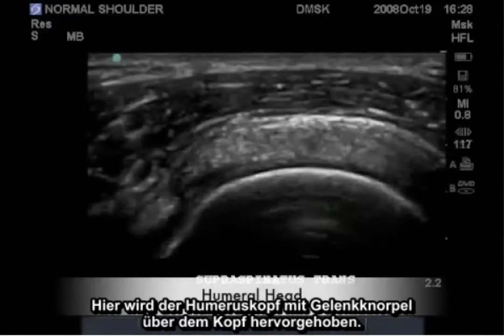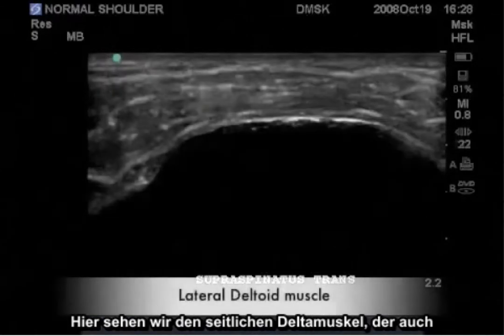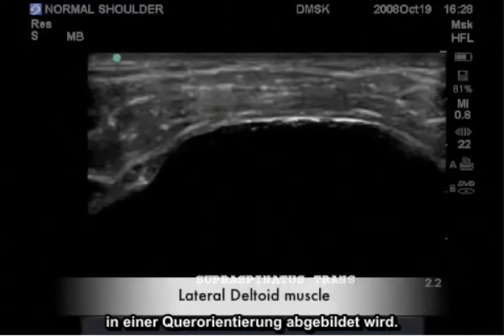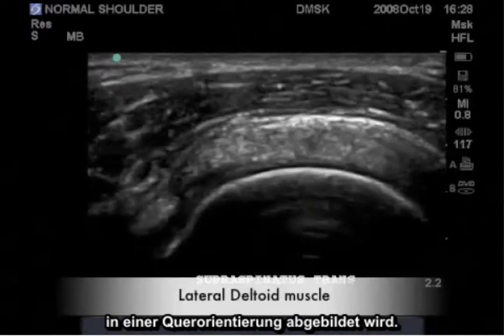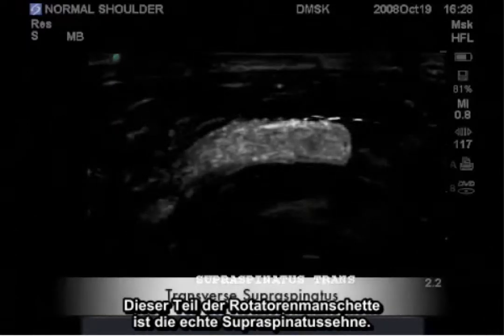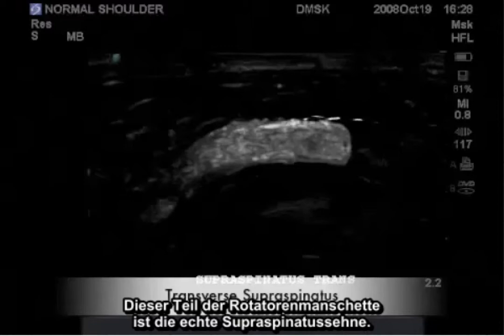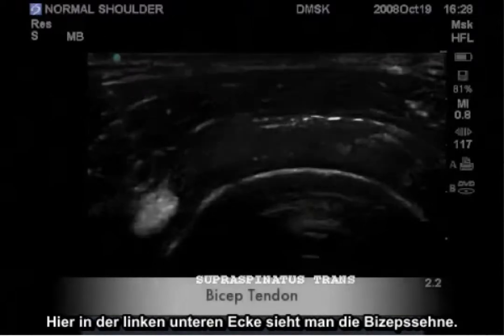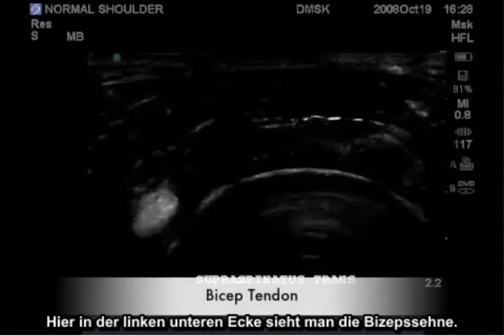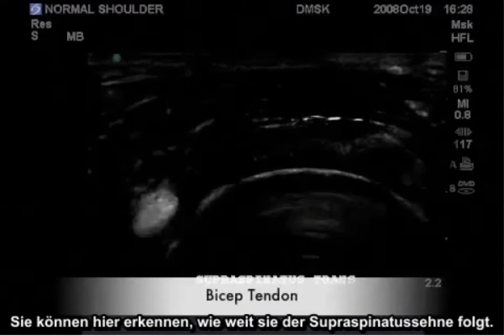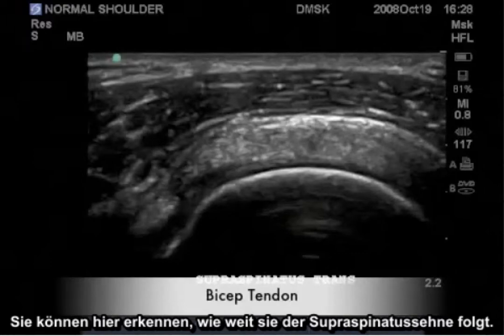Here we have highlighted the humeral head with articular cartilage over the head. Here we have the lateral deltoid muscle also imaged in a transverse orientation. This portion of the rotator cuff represents the true supraspinatus tendon. Shown here in the lower left corner is the bicep tendon, and you can see here how close it follows the supraspinatus.